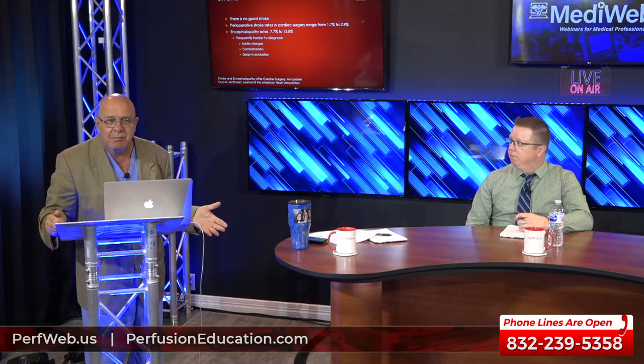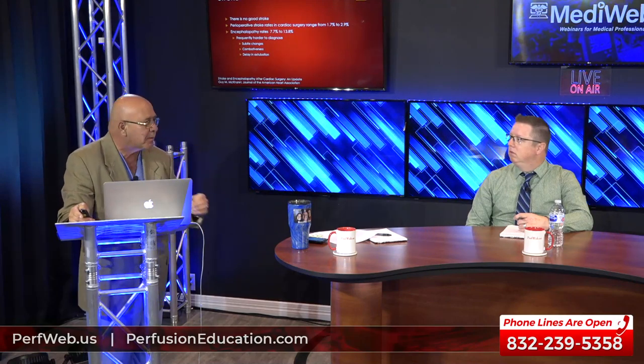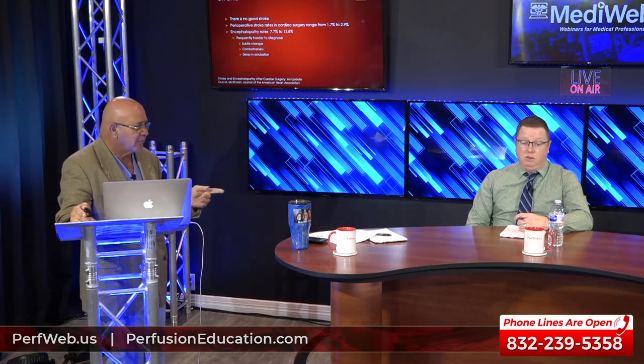If your pre-op value is 60 and you go on pump and it's now 38 or 40, and your hematocrit is 18, 20, and you can't flow anymore, make an adjustment. We don't like to give blood transfusions, but guess what? I feel you are obligated to give that patient a transfusion. I feel you have a responsibility at that point to treat that. If you're going to use the data, then use it. That's how I feel about that.